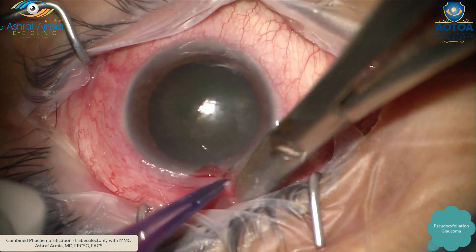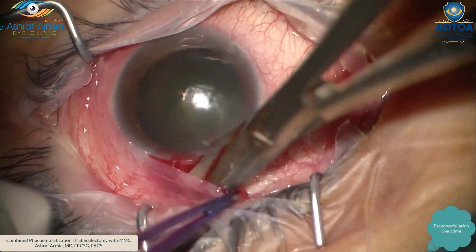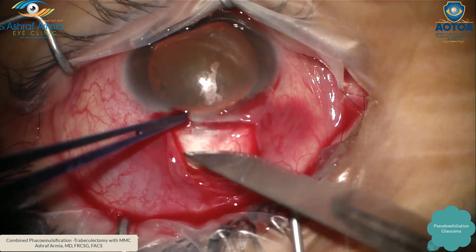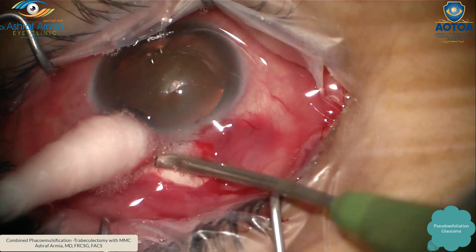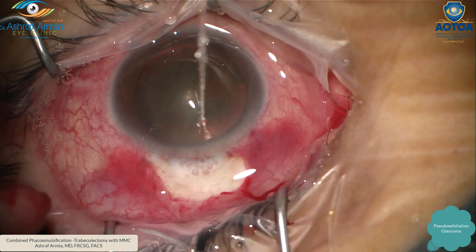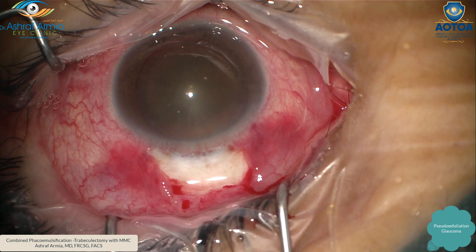Taking the conjunctiva and the tenon, then dissecting under the tenon to make the sclera bare in the area where I'm going to do the scleral flap. Good shaving of the area, then cauterize under wet field. Don't do too much cautery — as soon as you feel there is no more oozing of blood, stop.